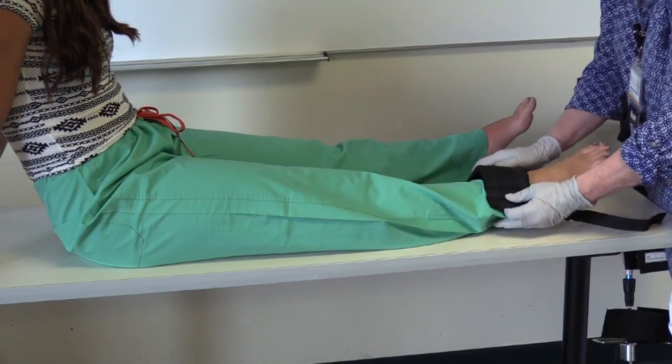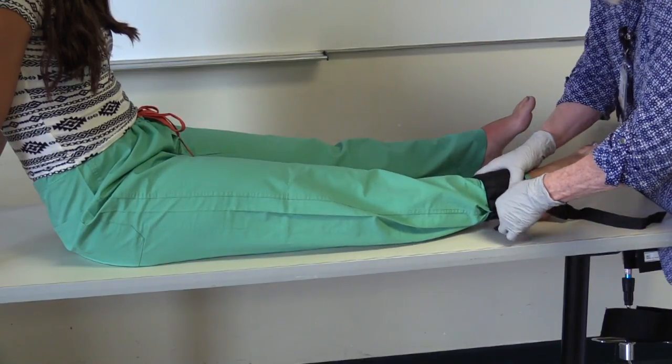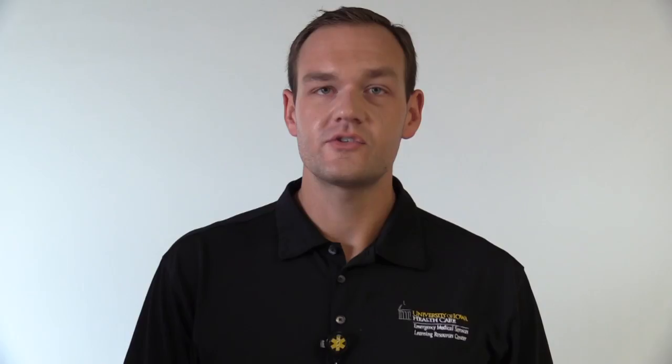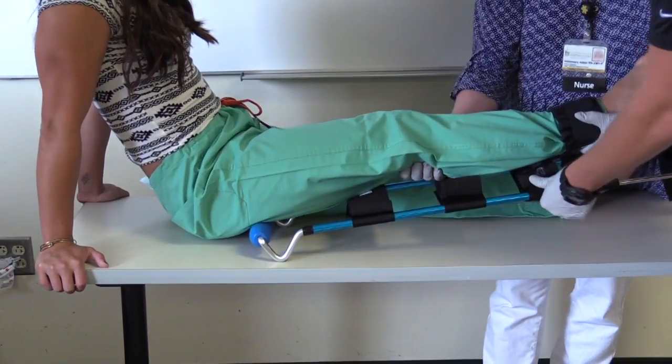I will then have my partner secure the ankle hitch and pull moderate in-line traction. I will measure the traction splint on the uninjured extremity with the device extending about 8 inches beyond the foot, and tighten the ratchet strap to stabilize the device.